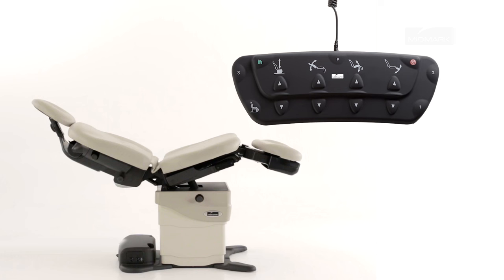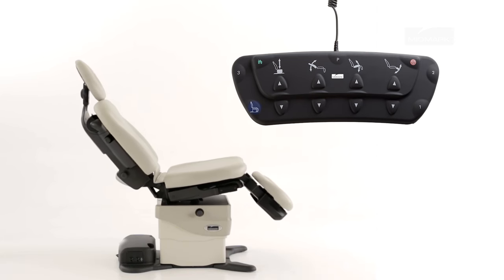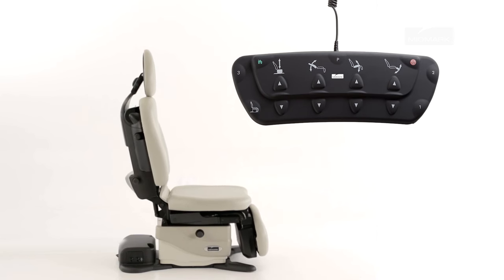The quick chair function activates the base down, tilt down, foot down, and back up functions at the same time. To activate the quick chair function, press and hold the quick chair button. Movement stops when the chair position is reached, the quick chair button is released, the active sensing technology is activated, or the stop button is pressed.